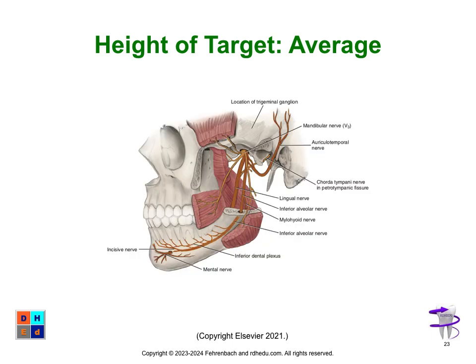So what nerve are we numbing here? Okay, this is another view. I want to put this view in, but as you can see, there is the inferior alveolar nerve. You can see that depth, and we need to play with that. Where's the height? Look how long that nerve is. How am I going to get my height?